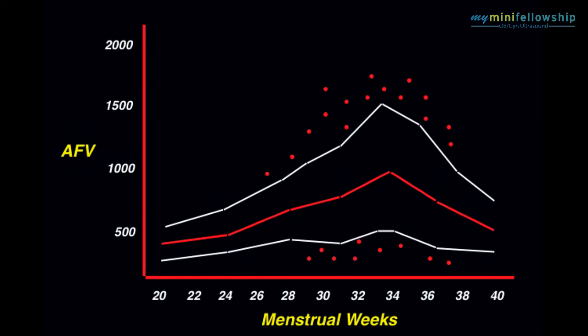Now, this may be a bit of a surprise, to realize that amniotic fluid increases to the 34th or 35th week, because visually on a sonogram it looks to us like amniotic fluid volume is its greatest at around 25 weeks of pregnancy. The reason for that is that our eye is an absolutely abysmal measurer, but it is absolutely fantastic at seeing relativity.